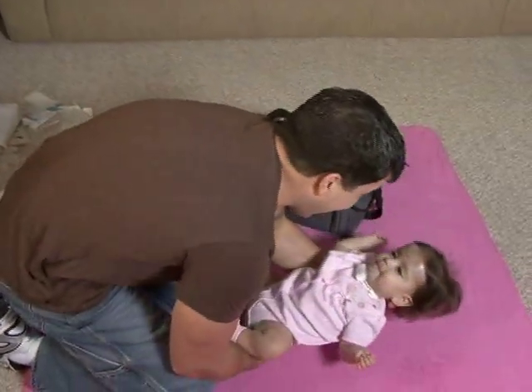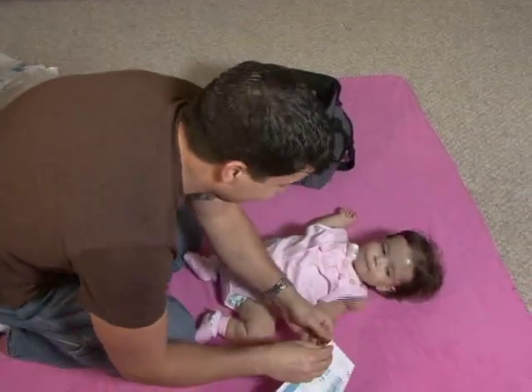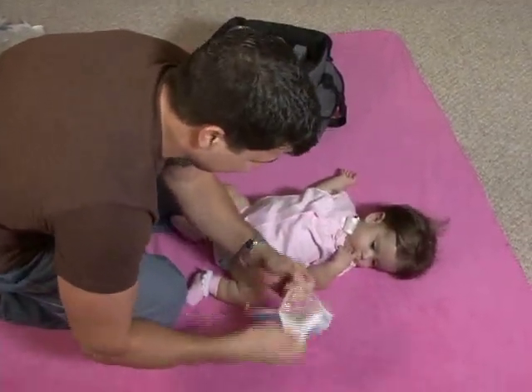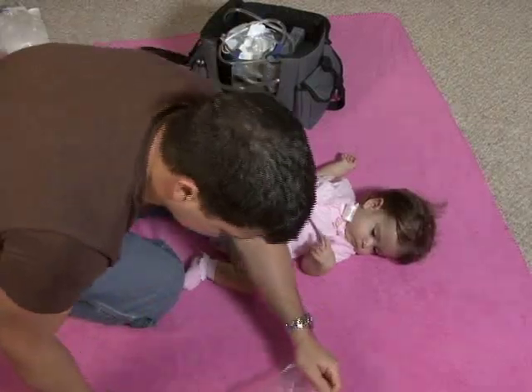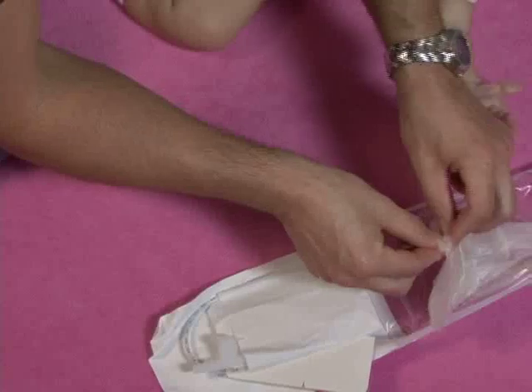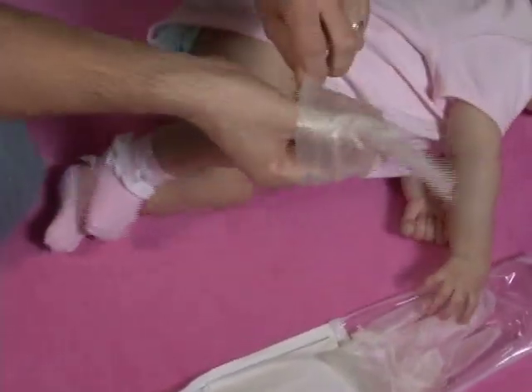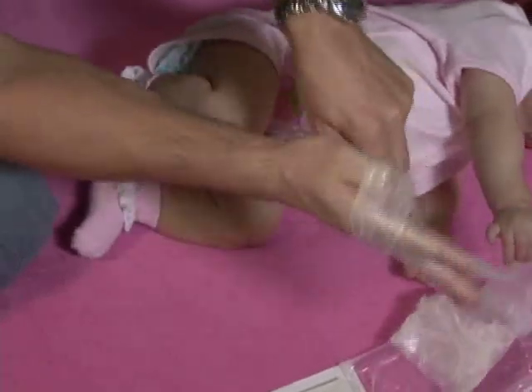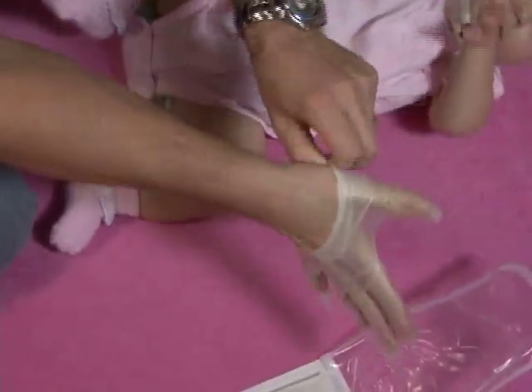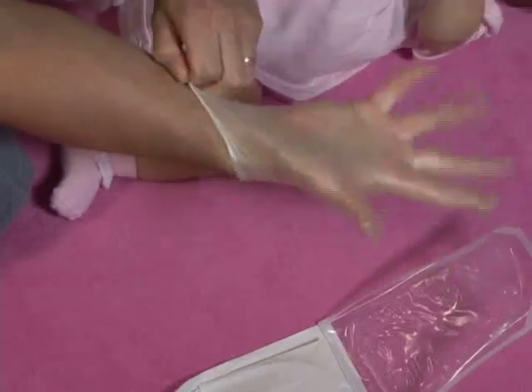Now let's begin. First, lay your child down on a clean surface. Then open your suction catheter kit. Pick up the glove in the wrist area, where it will have an inside-out section. Slide the glove on your dominant hand, being careful not to touch the exposed area of the glove. When you are first learning to suction, you may fumble with the glove, but don't worry — you'll get better at it quickly.